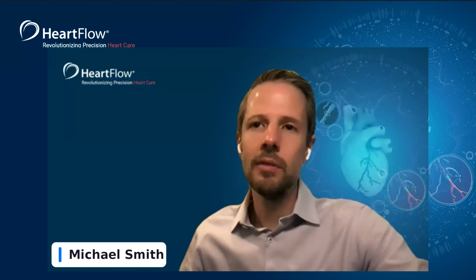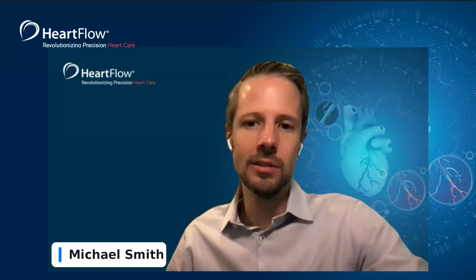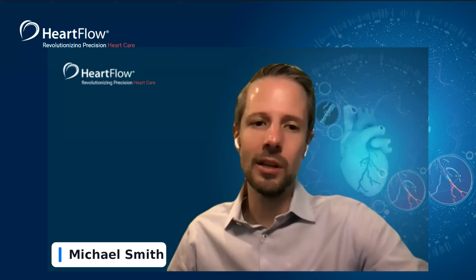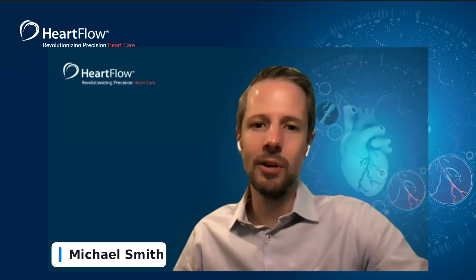Yeah, that's a great point there, Stefanie. If those epicardial vessels are not at maximal hyperemia, then we will think that they are on the HeartFlow side, even when they're not. And so we may call that positive, whereas in the cath lab, when they administer nitro and then adenosine to get maximum hyperemia at the microvasculature, they'll see what maximal hyperemia actually looks like, and it will be greater than what we saw. So yeah, that's a false positive that we would be providing back.